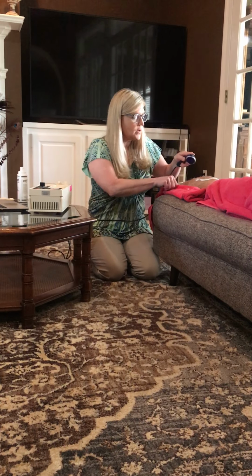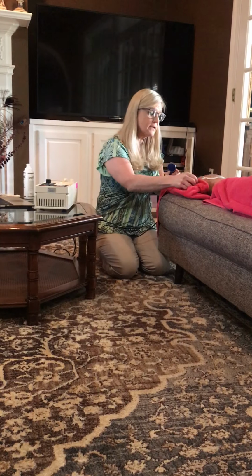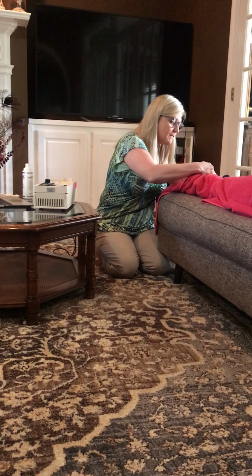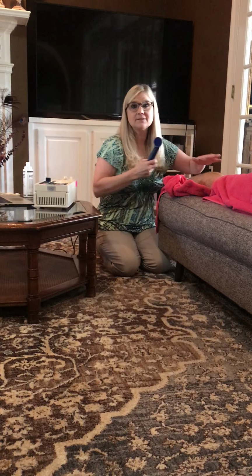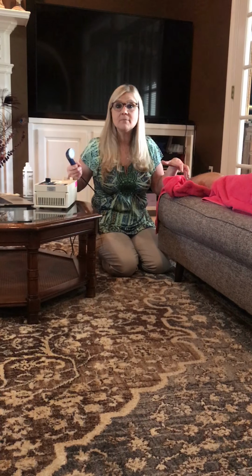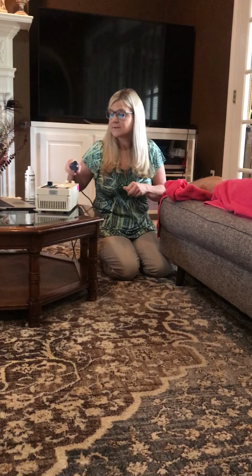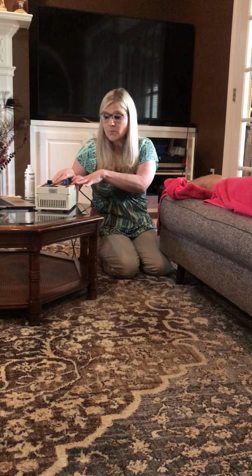Okay? We're going to clean our sound head. Also clean it with alcohol as well. We're going to wipe off the lotion. We don't have to clean his skin with alcohol because this can provide a moisturizing benefit as well to the area. And he also may be getting massage afterwards. Okay? So then our unit is turned off at this point.